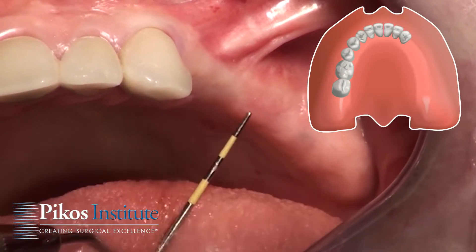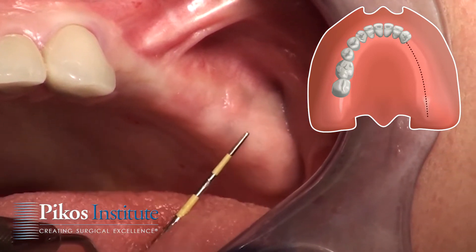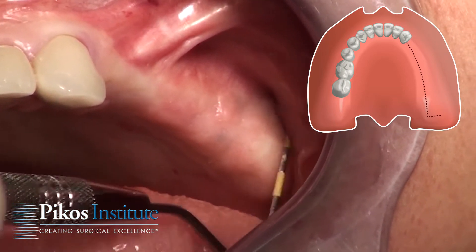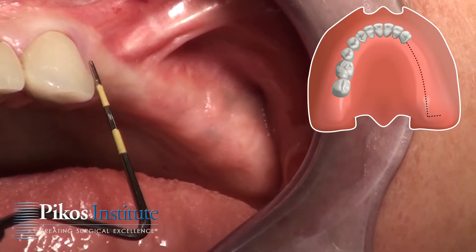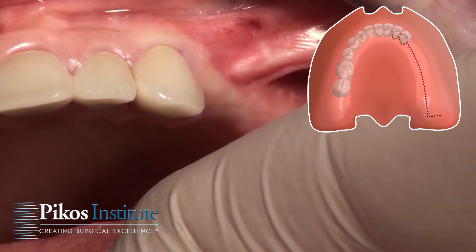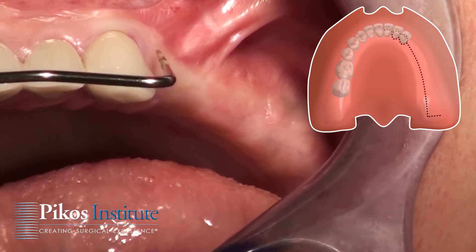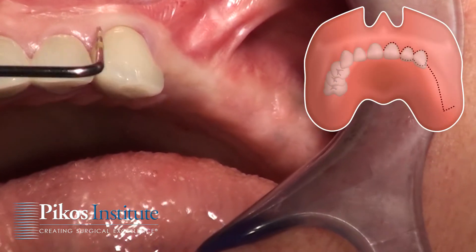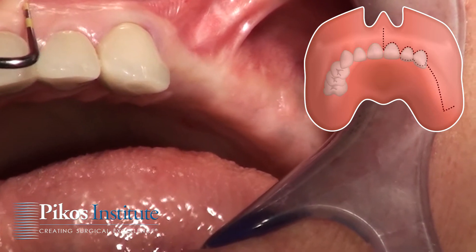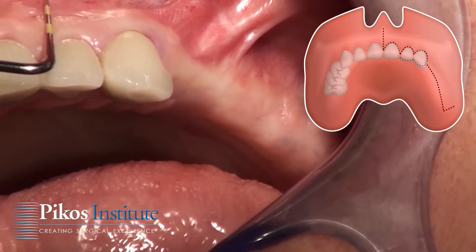Incision design for this case will be mid-crestal, and I'll carry this distally a fair amount. I might end up releasing it just anterior to the tuberosity or go through the tuberosity entirely. Continuing it anteriorly — ideally an envelope incision only for the anterior segment with a distal release only. But depending on what the ridge looks like, especially if I'm going to do a veneer graft, I might be releasing right in this anterior segment region.